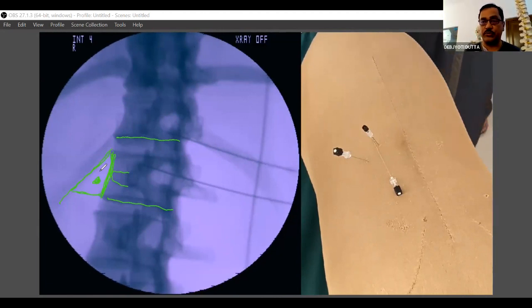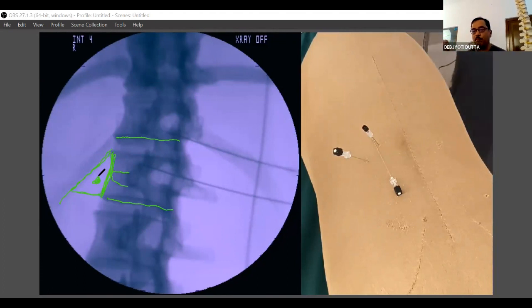It is a very painful procedure. But here we are not touching any bony structure. You just find this triangle bounded by the lower border of the rib and the lateral border of the vertebral body, imaginary, just the middle of that triangle. You go by tunnel vision and you will always be hitting the aorta unless a tumor mass is distorting it.